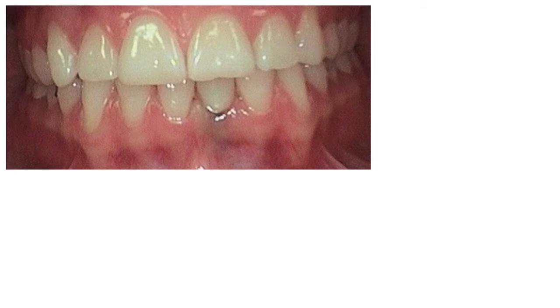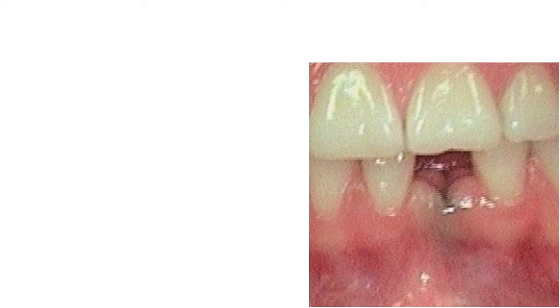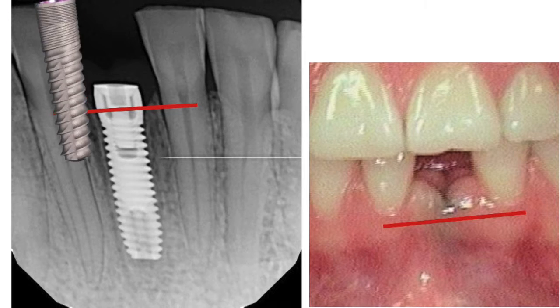This is another good example. This example was brought to us at the, I'm also part of the DDS mentoring with Gary O'Brien. This is a case that was brought to us showing this discoloration that was there. And they gave us an x-ray of what it looked like. And we noticed, hey, this probably should have been dropped down a little further than where it was at. I'll show you the x-ray right here.